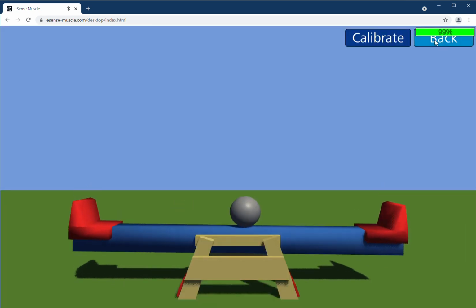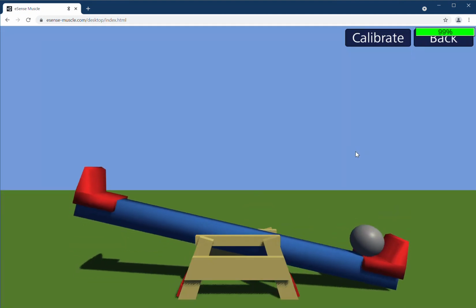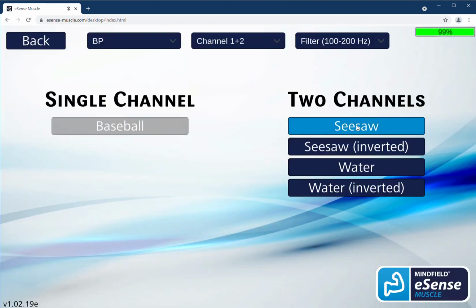So the seesaw inverted is just the same, but in the opposite way. When I contract the left arm, now you see the ball rolls to the right. Now the left side goes up, and now I contract the right arm and the right side goes up. So in some situations it's good to have it the other way around.